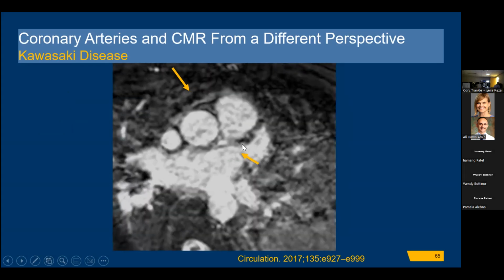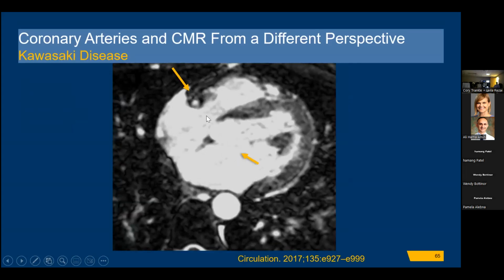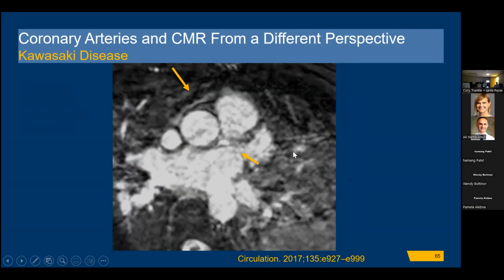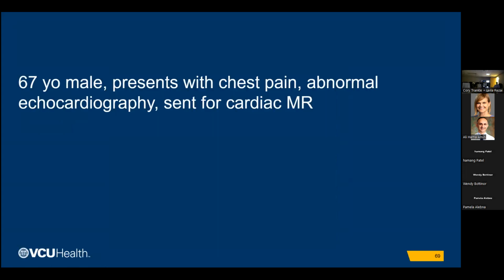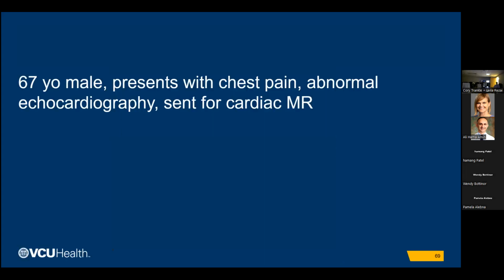So it's not just the left side that has the aneurysm, but the right side also shows an aneurysmal dilatation. Over this past few years that I had seen her studies, they all remain stable in size and does not cause any problem for the patient. All right. So this basically MRA and cardiac MR for patients such as this lady who have aneurysms that they don't need to repair, but follow-up is a very appropriate study because it mainly preserves them from extra radiation.